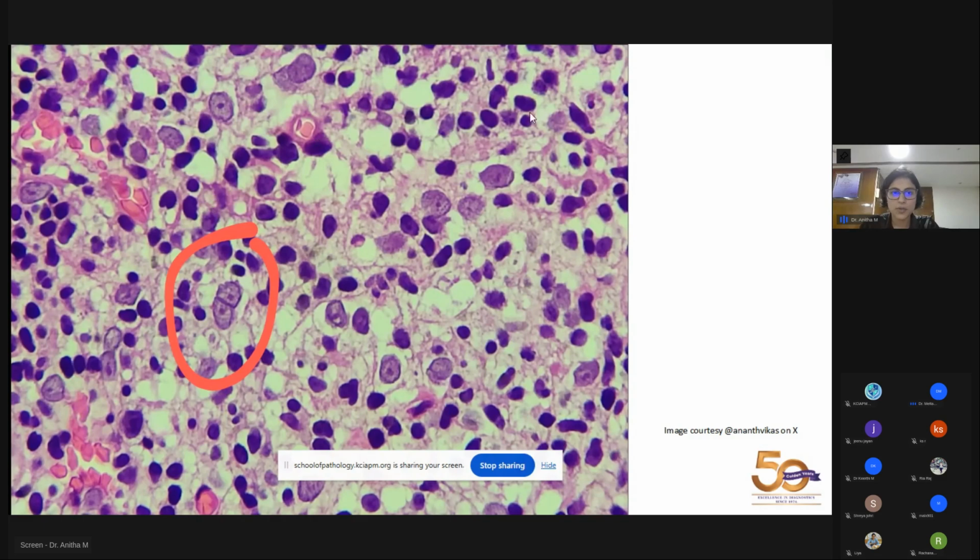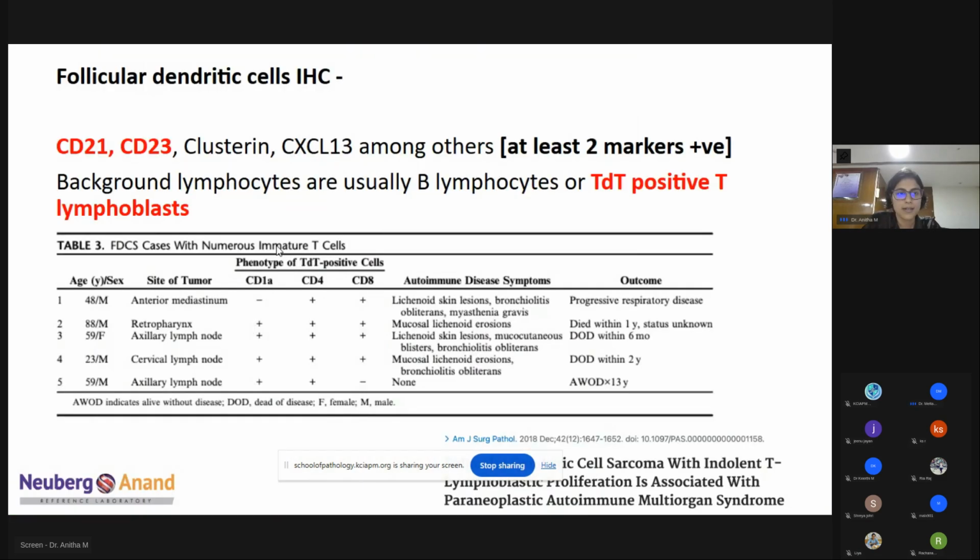Out of curiosity, do you know what is kissing disease? It's fine if you don't know. Infectious mononucleosis, right. That's kissing disease, and these are kissing cells.